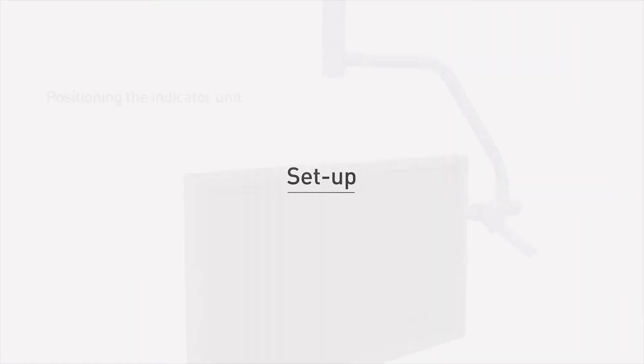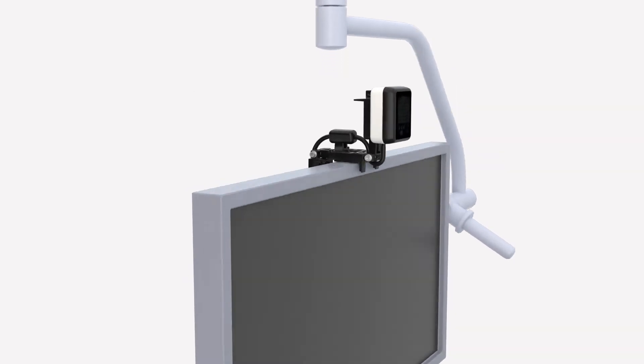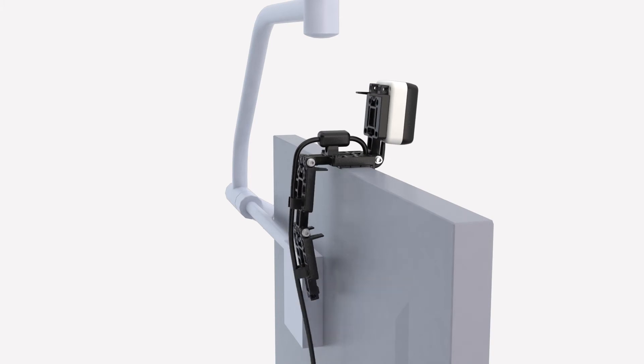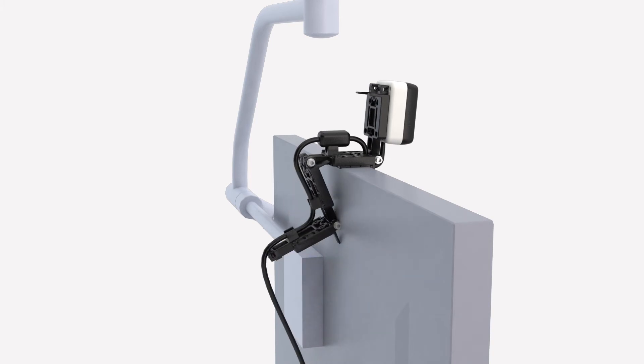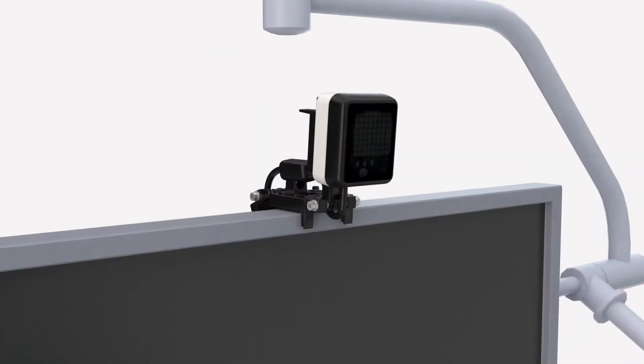Place the indicator unit on the top of the monitor at the midpoint. Ensure that the indicator unit is secured with the clamps provided before being set at the correct height and angle to allow the line of sight to the headset that will be worn by the surgeon. Plug in the indicator unit to display this image.